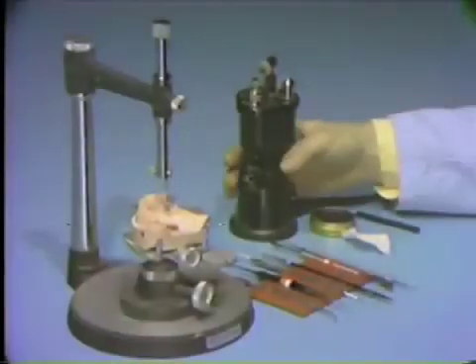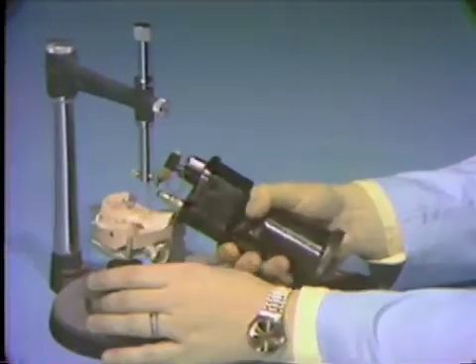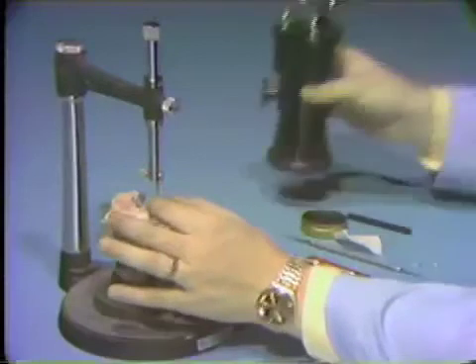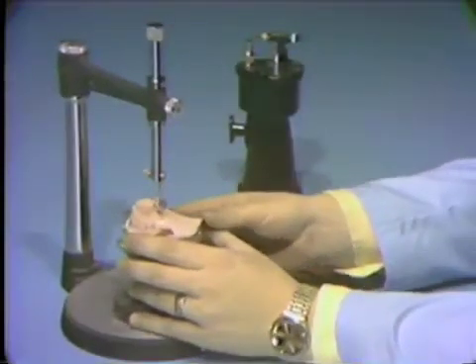Place the working cast on the surveyor at the correct path of insertion position by utilizing the straight handpiece rod. Place a wax carving rod on the surveyor spindle. Warm the carving rod with an alcohol torch, testing with your fingers to be sure it isn't too hot, and create the lingual guide plane by guiding the warm rod over the wax on the lingual of the tooth.